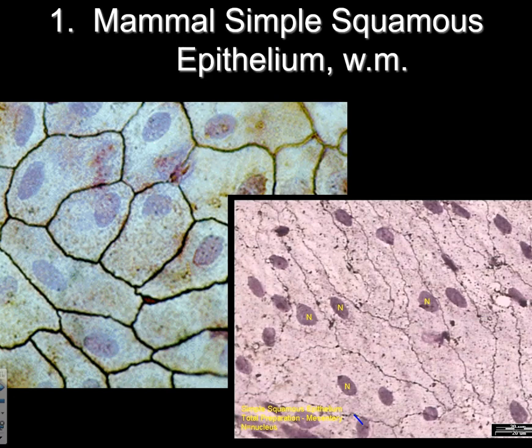One of the big characteristics of epithelial tissue is they always have an apical and a basal surface. There's always a section open to the air or not attached to other tissues, and a portion that is attached to other tissues, the basal surface. Right here, what we're seeing is just simple squamous. So simple, meaning a single layer of flat cells.